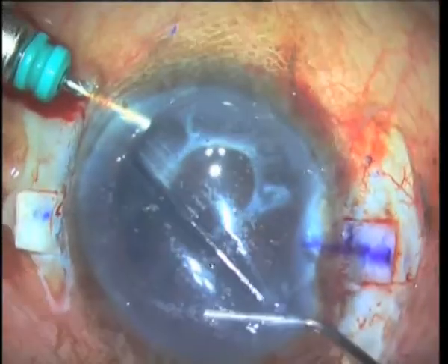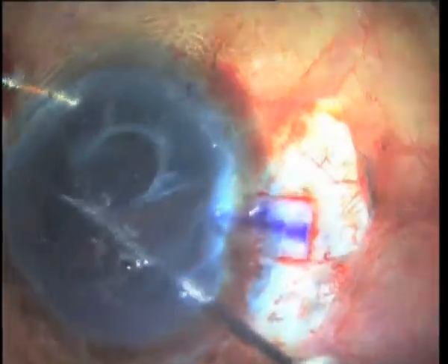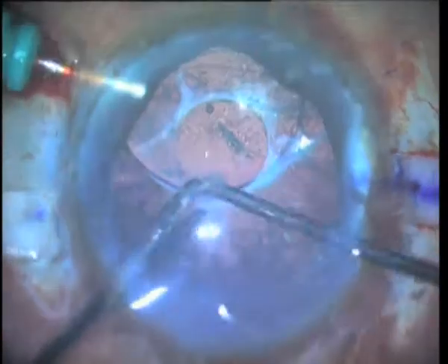Initial attempts are made to free the IOL of its adhesions with microsurgical technique forceps. While manipulating, we see to our surprise that there is an endocapsular ring in situ.